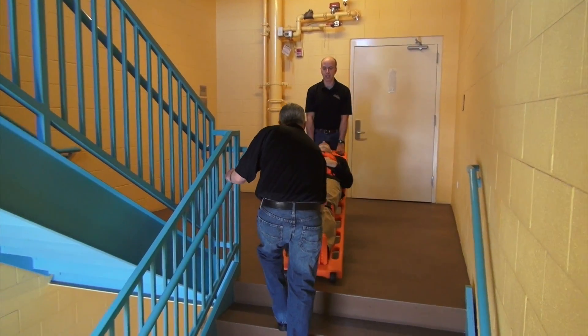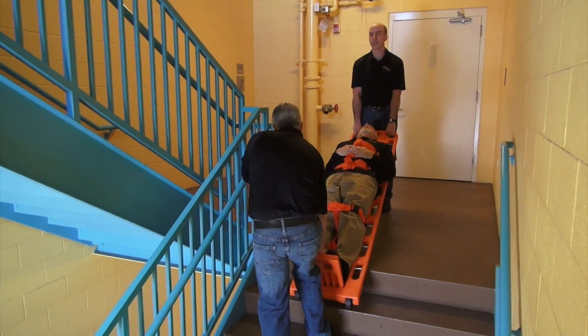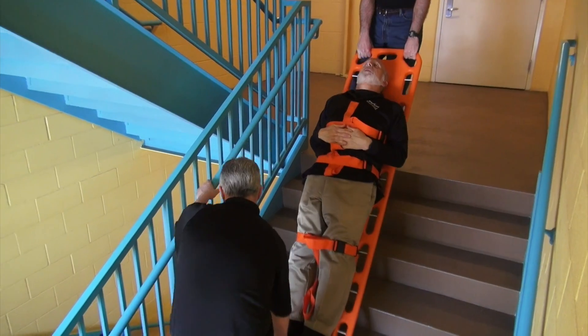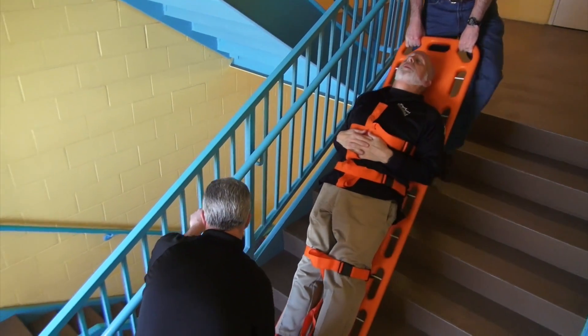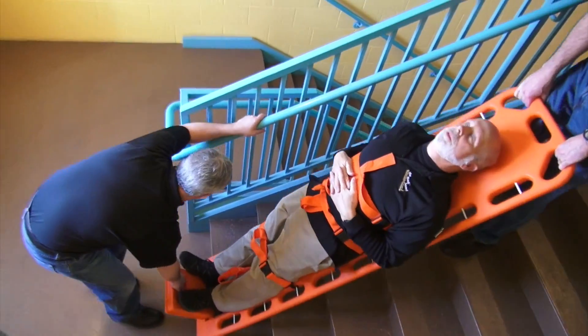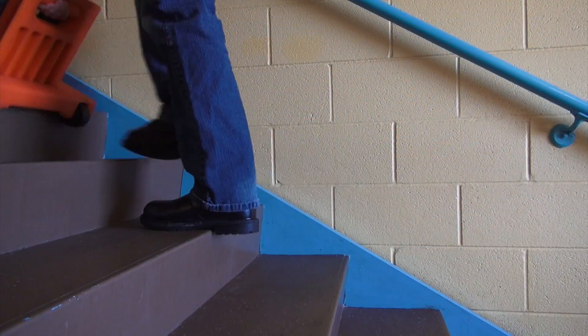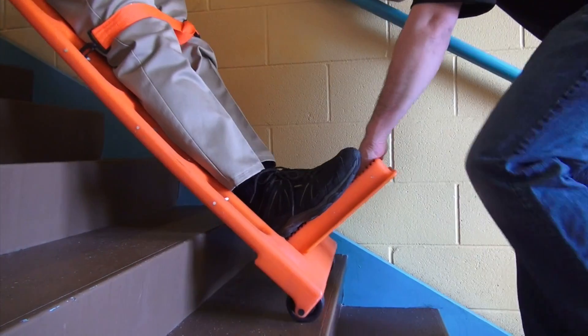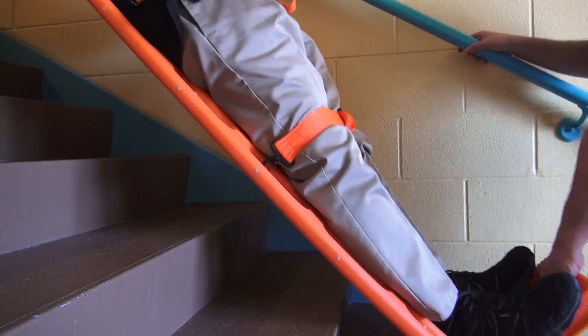By holding the walkboard low with straight arms, the paramedic at the patient's head puts the board at an angle similar to the angle of the stairs. This angle allows the walkboard to slide and be pulled forward over each step. The paramedic at the footrest should pull, not lift, the walkboard over each stair.